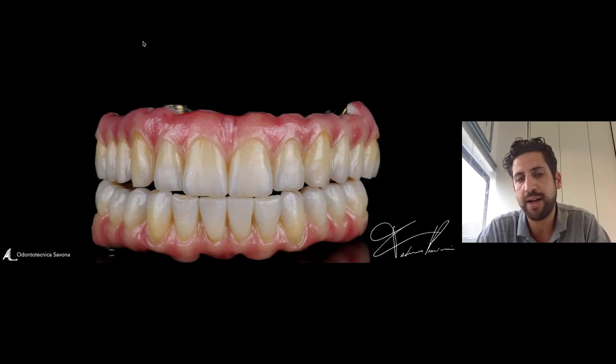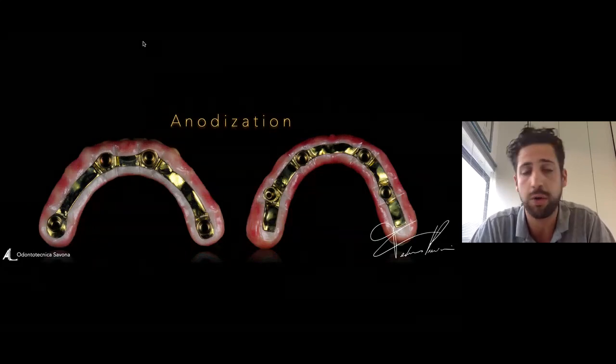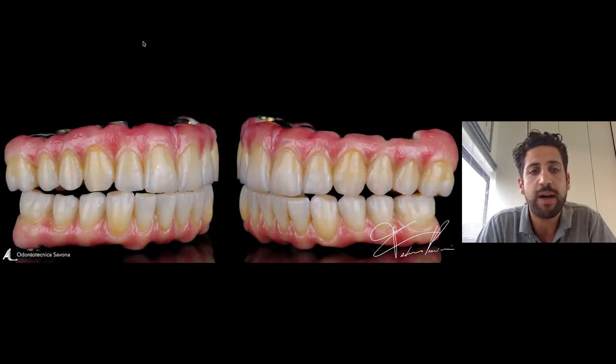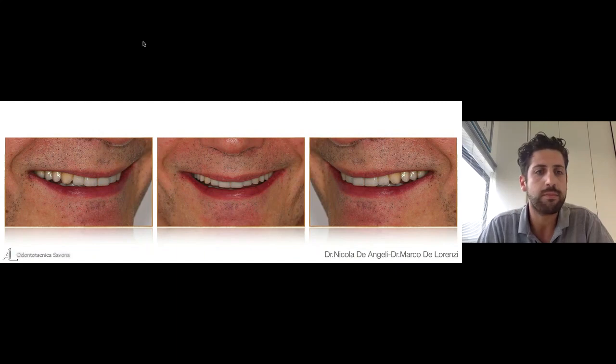And this is the final case with the cemented bar. We anodized the bar in gold. I really like to use the gold color. Also, you can do it in violet, pink, or any other color. We glue it. Final pictures, and this is the patient with the final restoration.